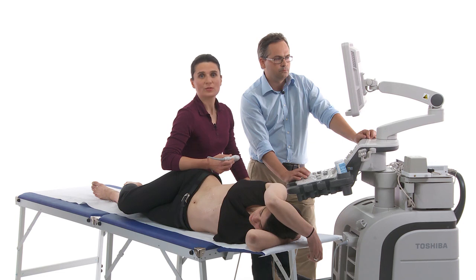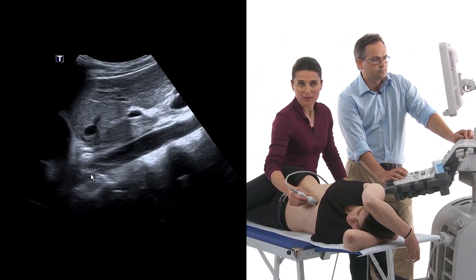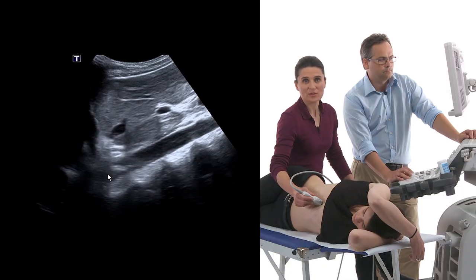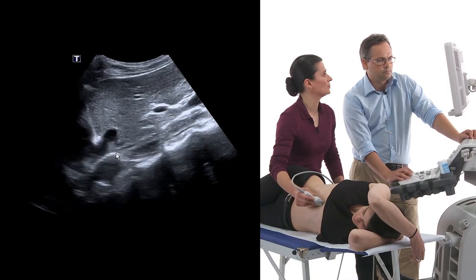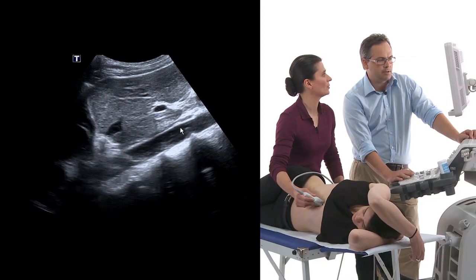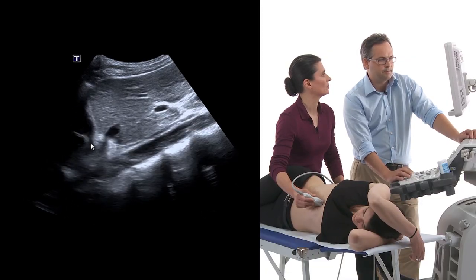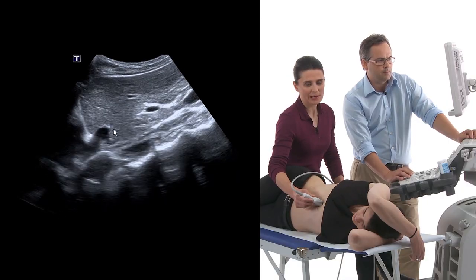Next, we proceed to the longitudinal subcostal view. We ask the patient to turn into a left lateral position. Again, I place my probe in the epigastric area in a longitudinal position. And now I move my transducer to the right side of the patient along the costal arch. You can nicely see the aorta over here, the heart beating here. Left liver lobe. And now please inhale.